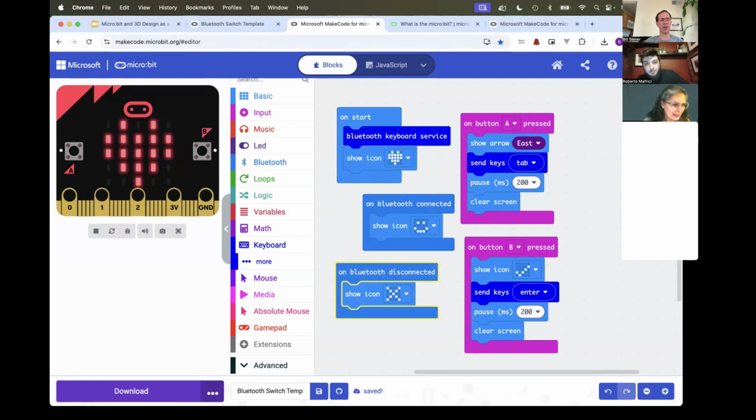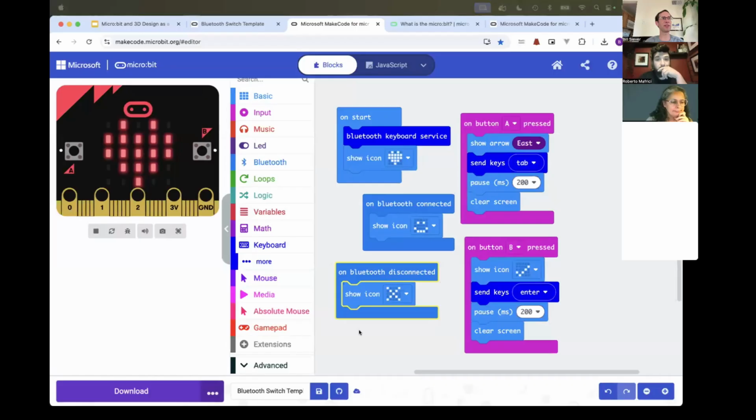Yeah, the BLE stuff is pretty cool. Again, I'm going to stop sharing very briefly while we clear the screen, and I'm slowly evicting people who are drawing on my screen. Oh, yeah, there was a question about adding some sound and some feedback. The Microbit does include a speaker, so you can actually do some sound in response to someone clicking on a key. So, any other questions?